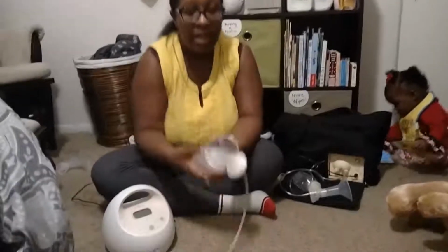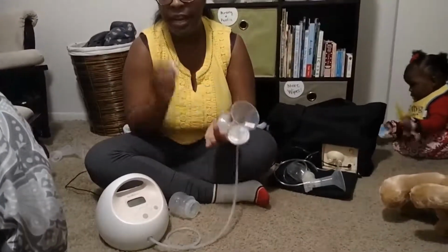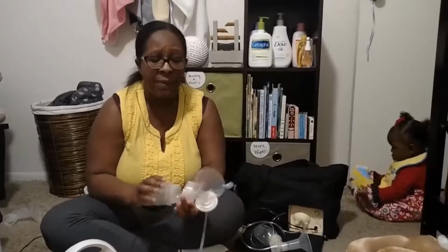Well, one of my secrets is, make sure that your parts are in good working order. I got new little diaphragms. I got a lot of them for $10. And so that has made a lot of difference. I'm back going strong in my game. So that is another secret.